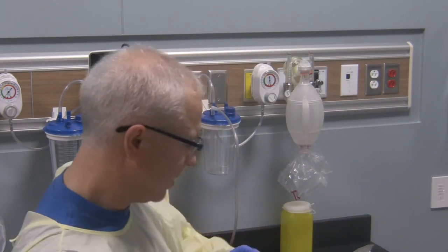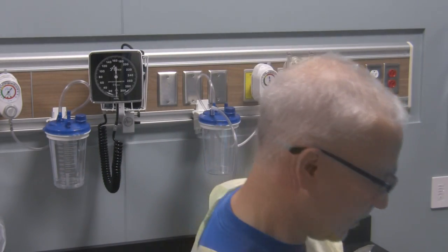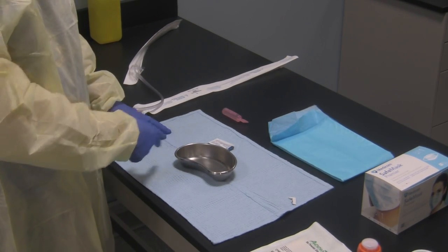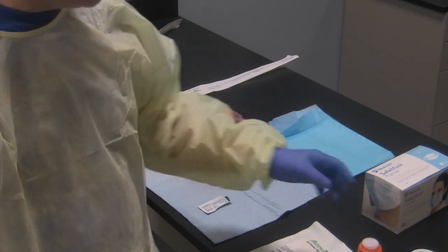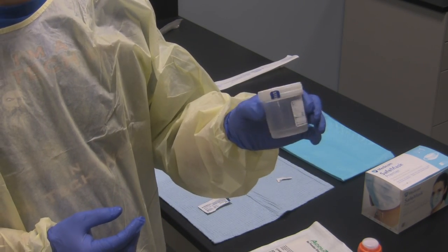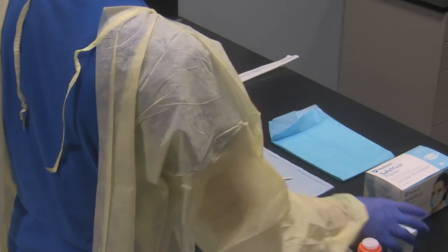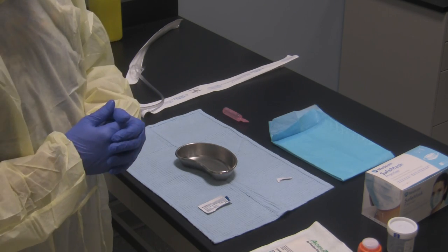I'll also get some saline and pour it into the kidney basin in case I need it. Again, this is clean technique — if it were sterile technique make sure you adhere to that procedure. Here's the rest of my mucogel should I need it a second time. If you're taking samples to send to the lab, you'd put some sample into the sample container, label it properly, and send it. There's also a special type of suction and collection unit used specifically for aspirating samples to send to the lab.